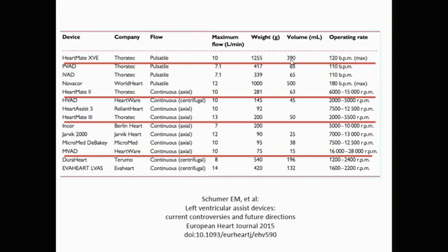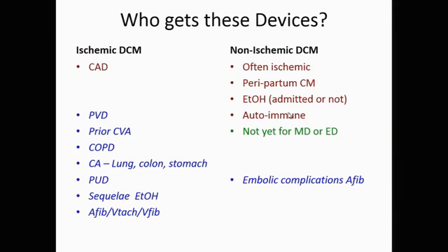You've gone from enclosed volumes that are 390 mLs down to an enclosed volume that's about 15 mLs, about half a shot glass of whiskey. You could literally take several of these devices and insert them in the chamber of a HeartMate XVE and have some room left over. It's impressive how much these things have changed.